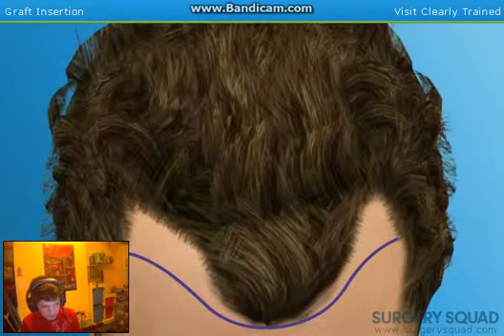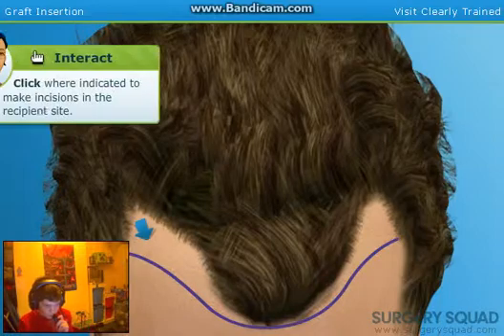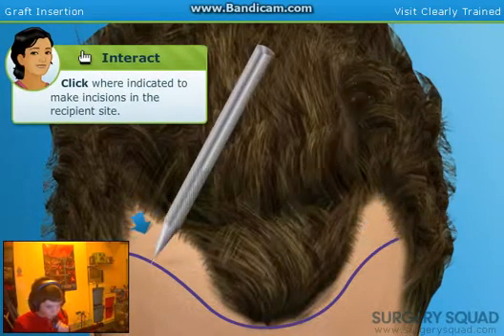Now we need to make tiny incisions into the recipient site so that we can place the grafts into the scalp. Use the microblade to make the incisions in the recipient site.